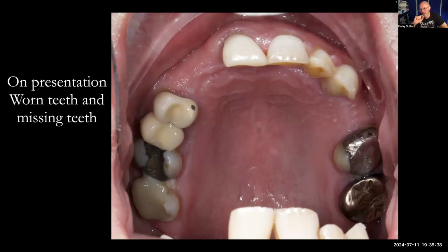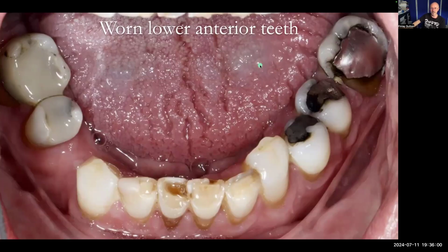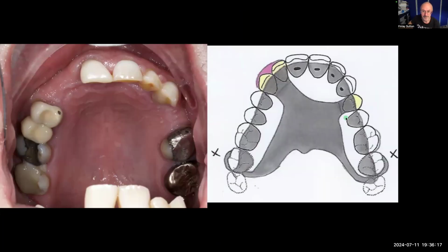So I'm really thinking about something where we've got metal on the denture that sits over those teeth and also opens the bite up. You can see here the lower incisors actually occlude onto the gingiva on the inside there. I see that a lot with these deep class 2 division 2 overbites. These are his lower teeth, quite worn anteriorly and relatively heavily restored posterior dentition. Just a normal sort of British patient that we see quite regularly.